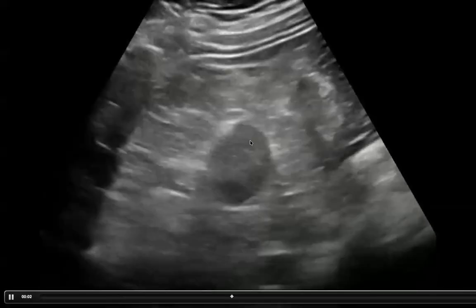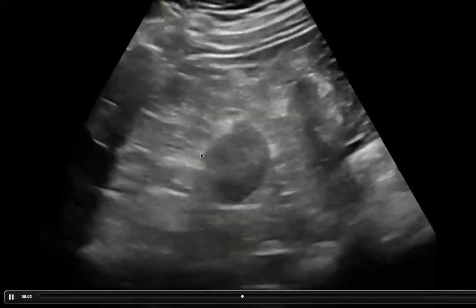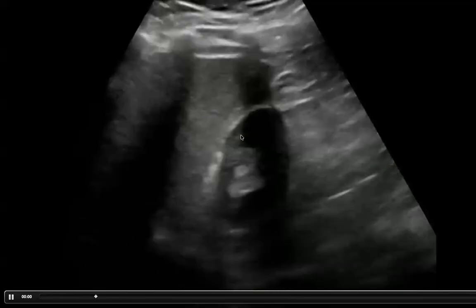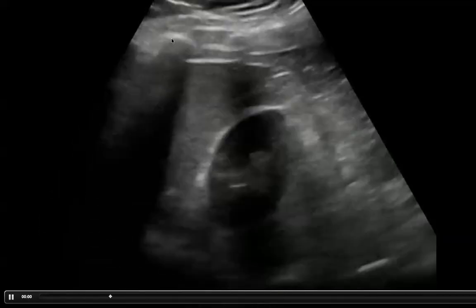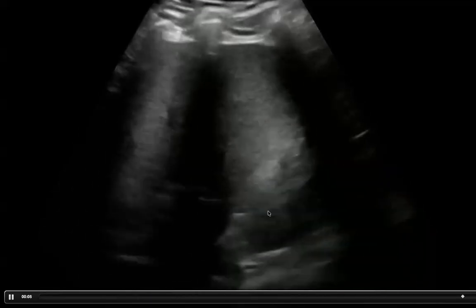Here is another picture of the kidney, and now we're looking at the kidney in the short axis. And so we're scanning through that kidney from one side to all the way to the other side. Okay. And again, there are some rib shadows in view here. In rib shadows, there's rib and then a shadow all the way down towards the bottom side of the image.